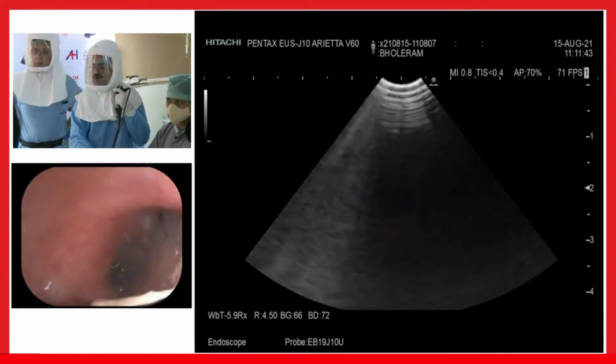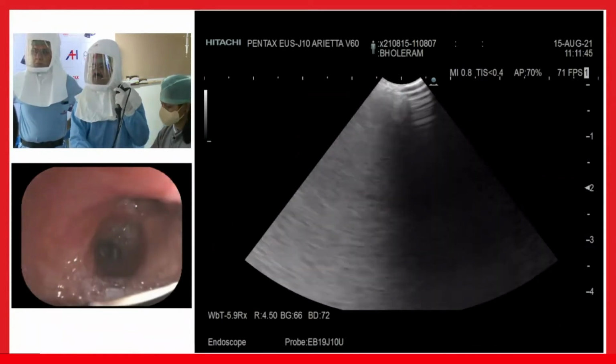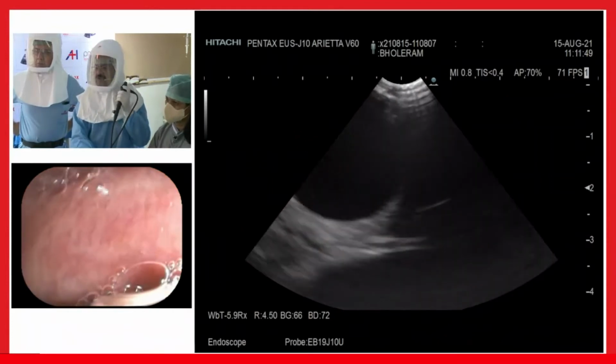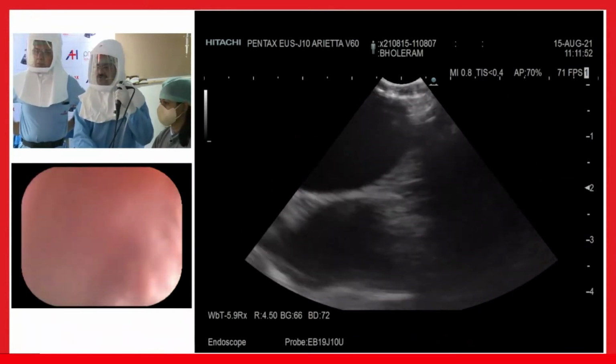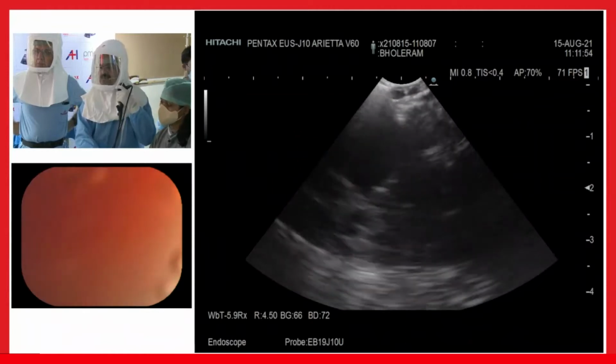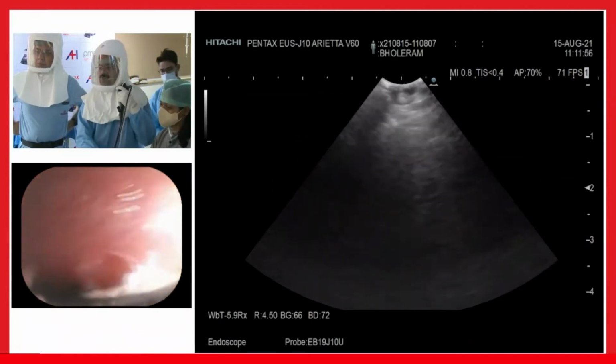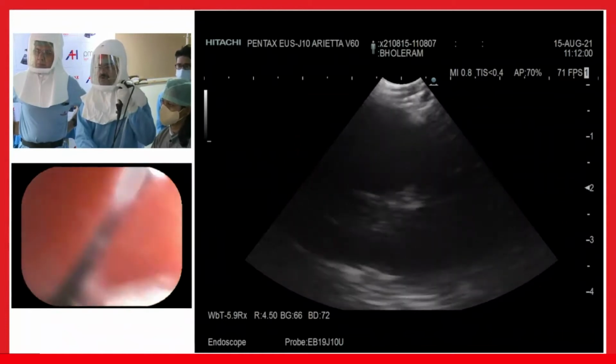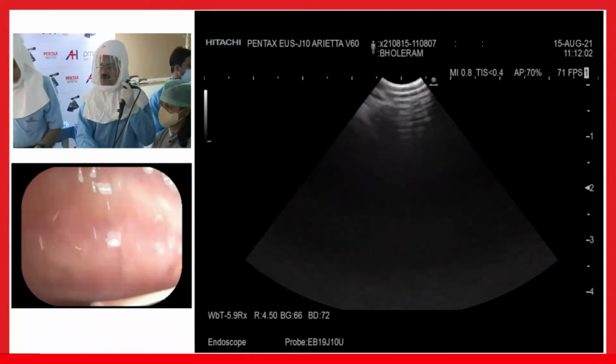Yes. At the level of the carina, just at the level of the carina, if you touch the right lateral wall or anterior wall at 3 o'clock position, you can visualize the right paratracheal 4R lymph nodes. We call them 4R lymph nodes from the 12 o'clock anterior to the 3 o'clock on the right paratracheal area.